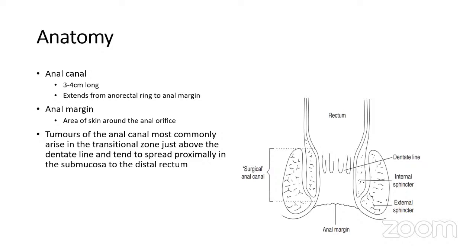So I think Dr. Kannan, you can go ahead with your second part of the talk. Next is the anal canal. So I would be covering this. Then I have some cases. If some people are interested in seeing the contouring of some structures, you can tell me. I have the images. I can show you and contour and show you.